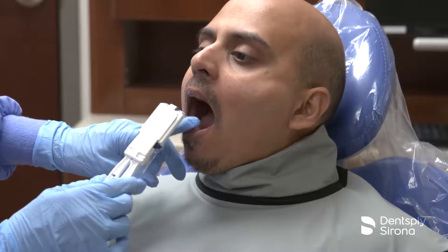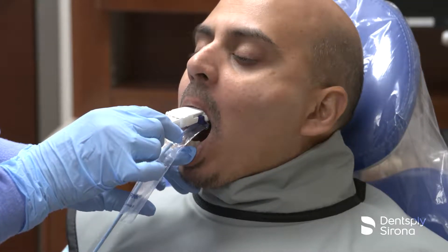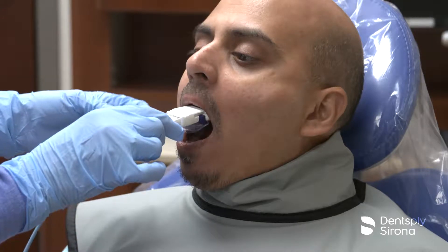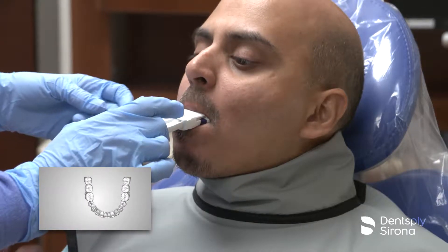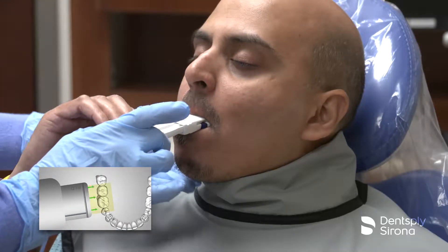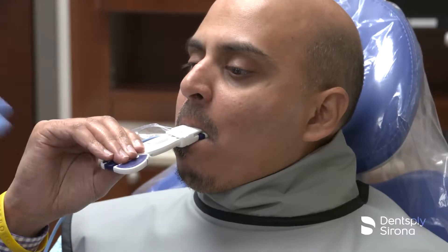The sensor should be placed behind the teeth of interest to be radiographed, with the lower portion of the sensor up against the incisal edges for the bisecting technique. Once again, the X-ray beam is directed to pass between the contacts of the teeth being radiographed in the horizontal dimension, just as it is in the paralleling technique.